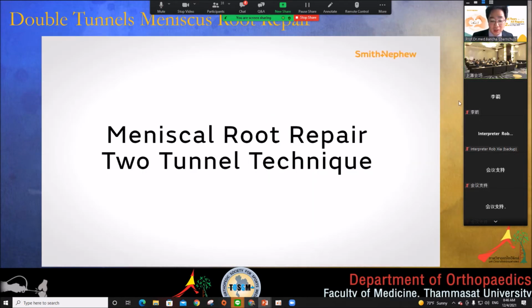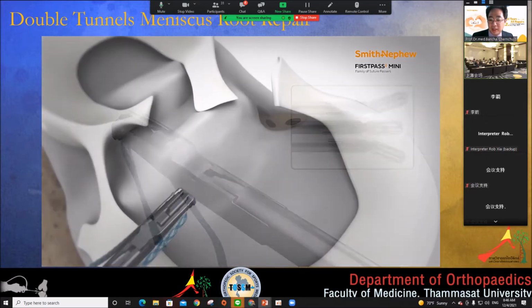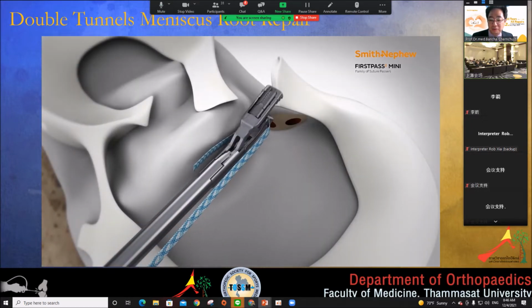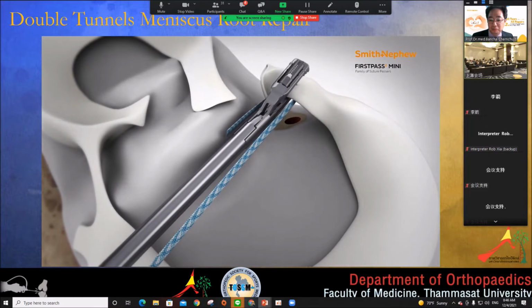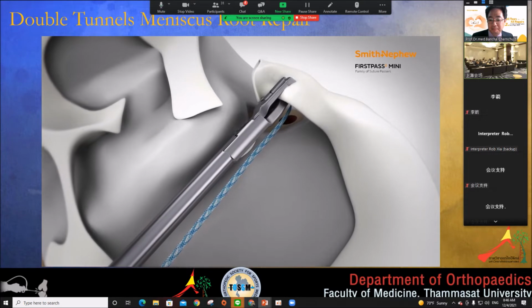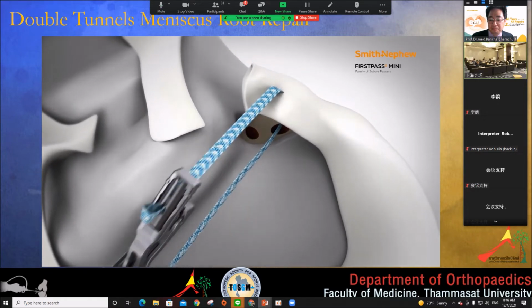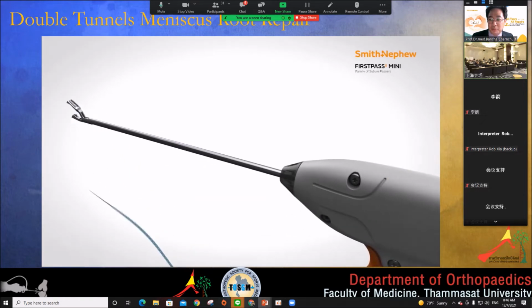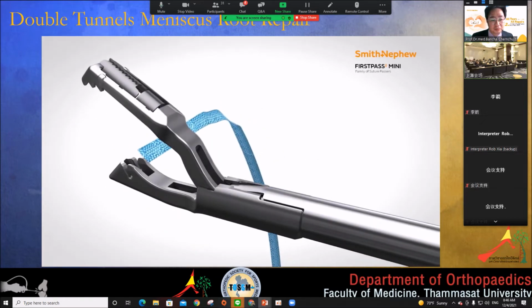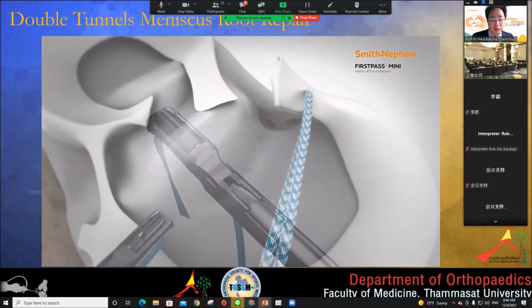Okay. So after that, you pass the suture into this straight, right curved, or left curved. First pass. Okay. A straight ultra tape or number 2 suture is easily loaded into the bottom jaw of the first pass mini suture passer. By simply squeezing the hand trigger, the preloaded needle will pass suture through the tissue into the self-captured jaws. This is a self-captured jaw. Okay, like that way.